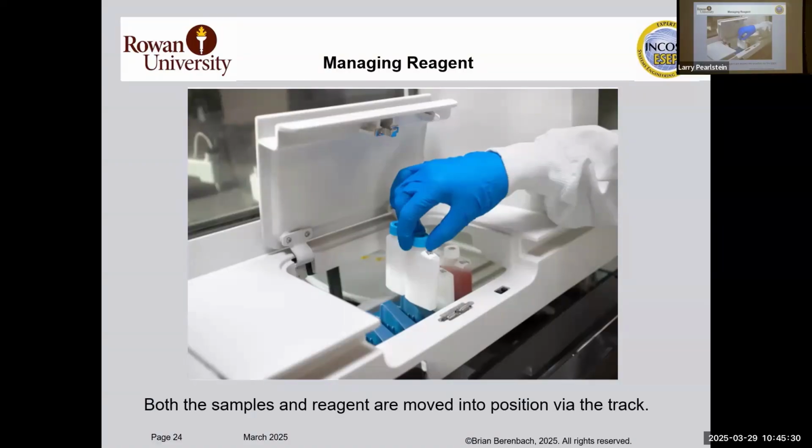And then you have to interact with the salespeople, the mechanical engineering people, the chemistry people. I had to go to 3 different locations to talk about how we were going to connect the station to the analyzer, because each location I went to was doing a different type of analysis. And we had to coordinate with all 3.